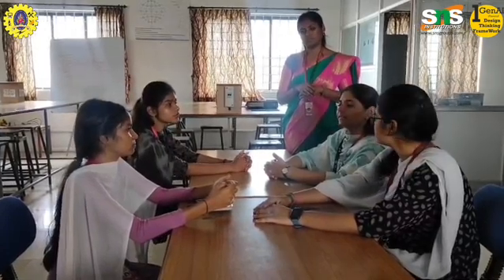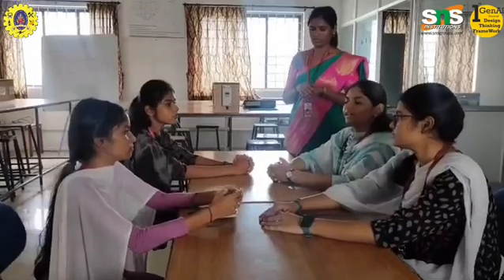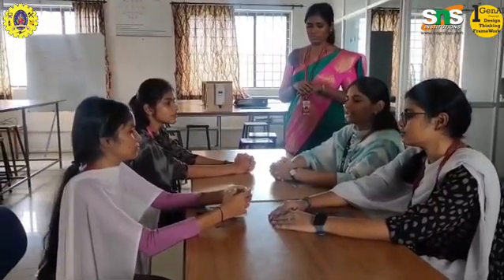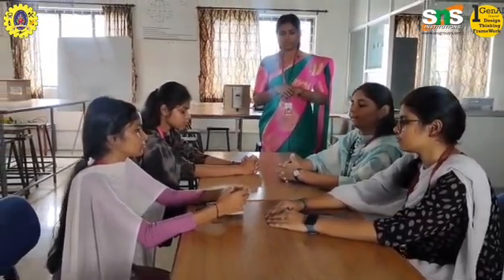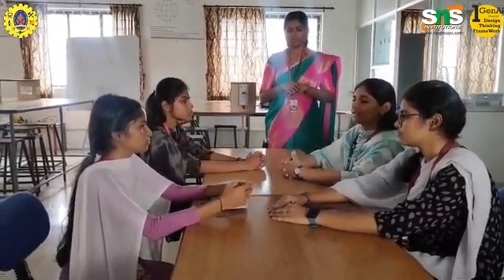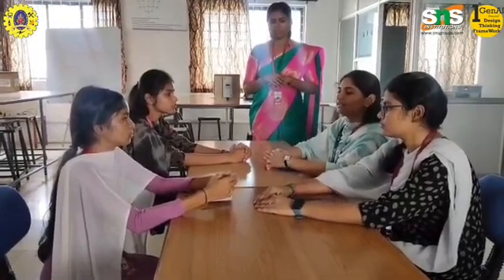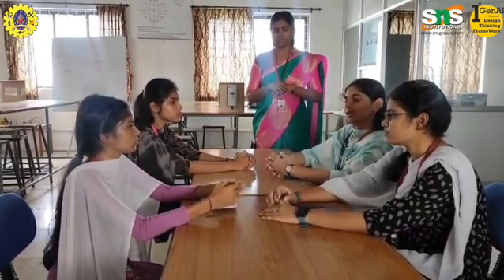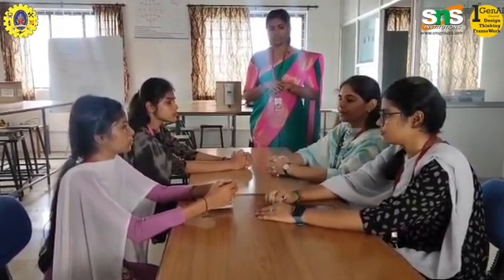Apart from advantages, there are some disadvantages as well. Some of them are that it cannot be used over some parts like the eyes, bones, reproductive organs, and on patients with metal implants. It is also expensive when compared to traditional methods. It may also cause burns if not applied properly.